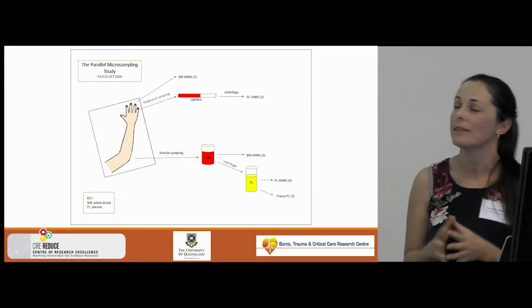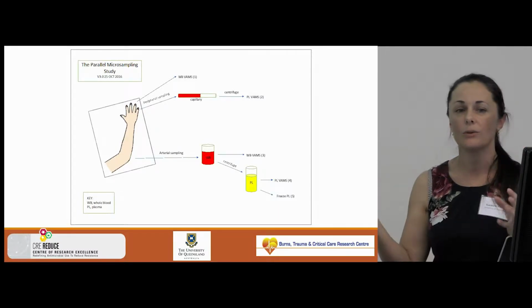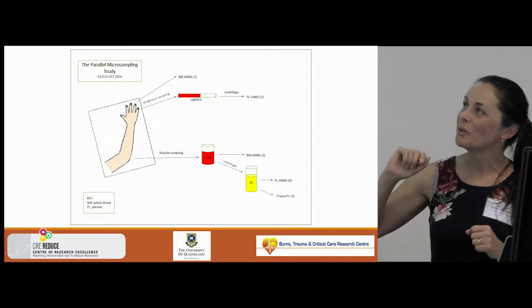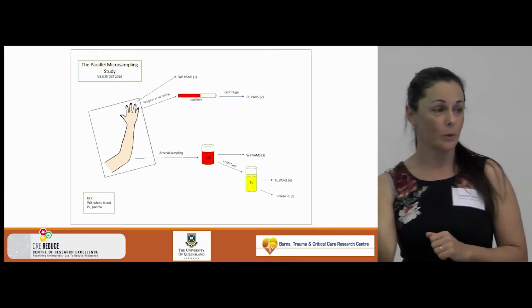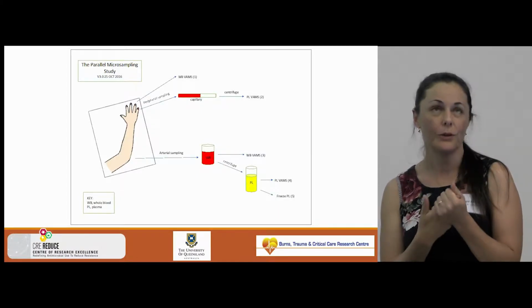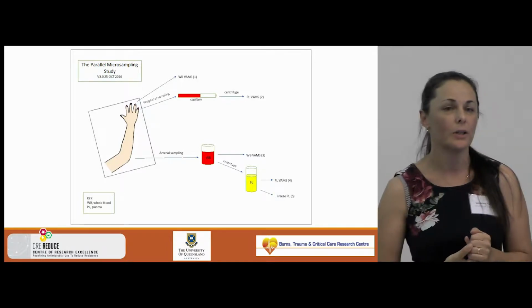So to compare these results and start to see the feasibility of these microsamples, we need to develop and validate 3 different types of methods. We need a liquid plasma bioanalytical validation. We need vancomycin in whole blood on VAMS, and we need vancomycin in plasma on VAMS.